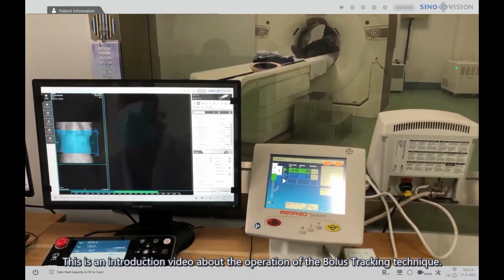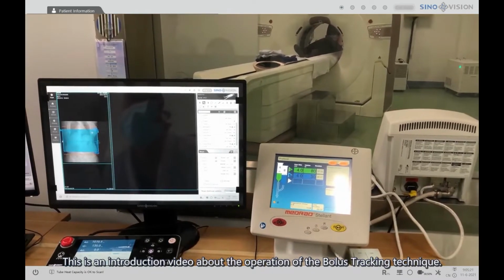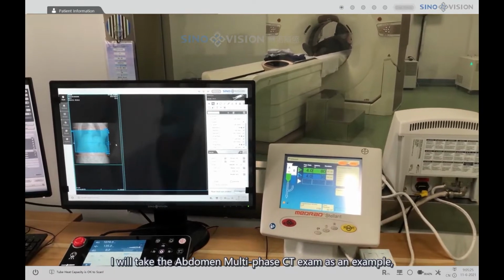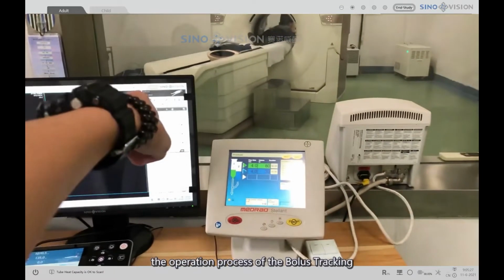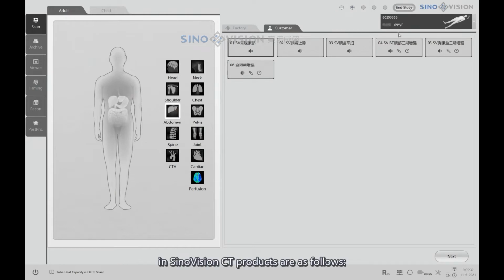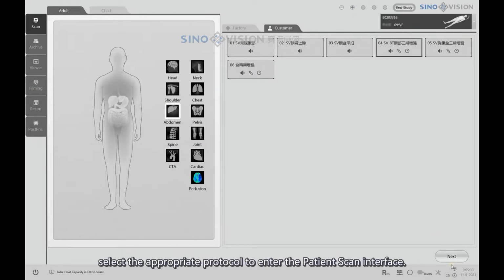This is an introduction video about the operation of the bolus tracking technique. I will take the abdomen multi-phase CT exam as an example. The operation process of the bolus tracking in Synovision CT products are as follows. After filling up the patient information, select the appropriate protocol to enter the patient scan interface.